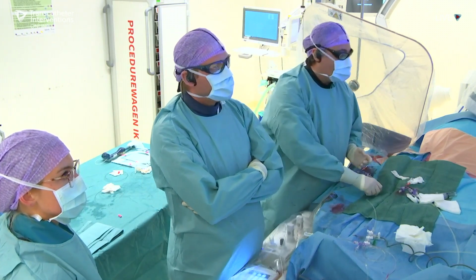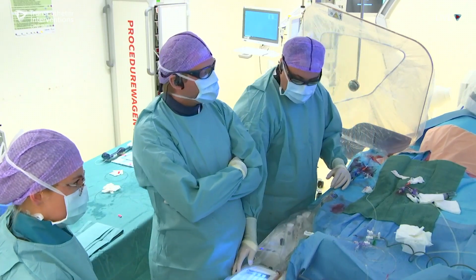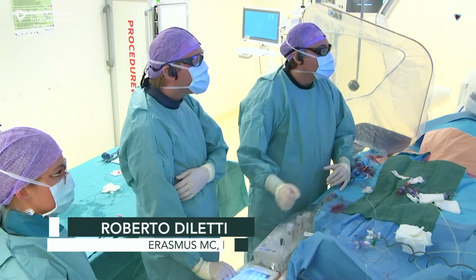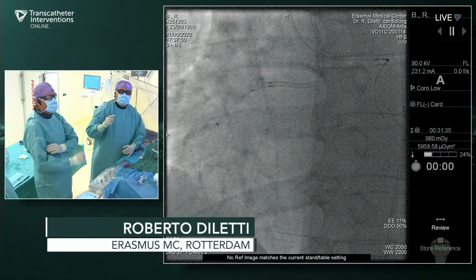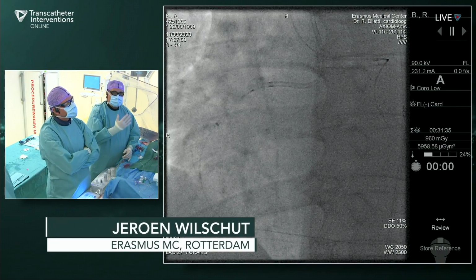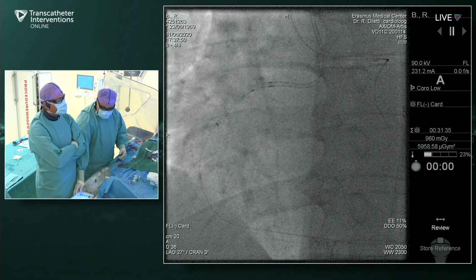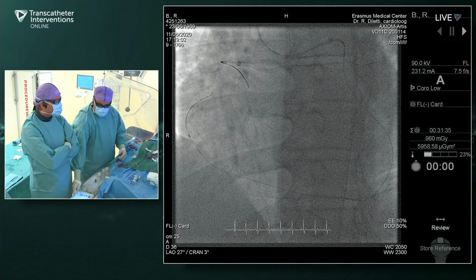Hello, hi, welcome back. It's a pleasure to have you back. So, what we did, maybe we can have a look. Oops. So basically, can we go back? Can I have back the? So maybe I can do this. Yeah. So what we did, we went in the distal right and then up to the proximal right. You can see the advancement of the microcatheter. Maybe I can show you there. Can you see our screen?